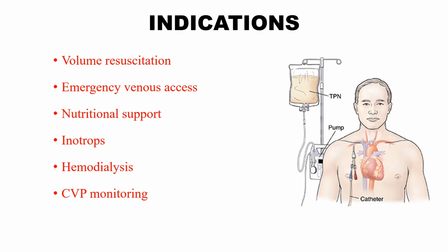Now let's see what are the indications for inserting a central venous catheter. One is volume resuscitation, emergency venous access, nutritional support, inotropes, hemodialysis, central venous pressure monitoring.